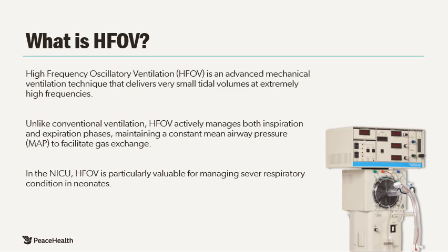In the NICU, high-frequency oscillatory ventilation is particularly valuable for managing severe respiratory conditions in neonates. Its clinical significance includes lung protection, management of severe respiratory distress, treatment of air leak syndromes, and improved oxygenation.